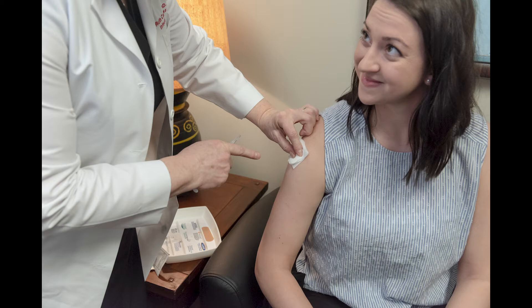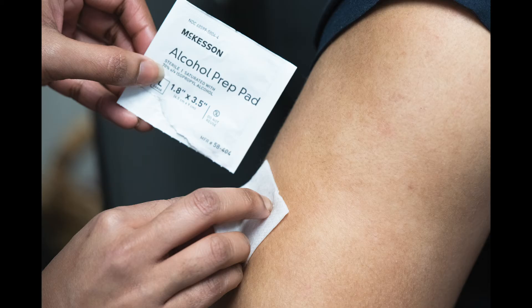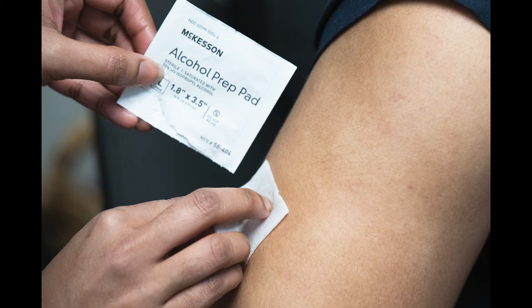Take your time and make the patient comfortable. Talk with them about assessing the site. Use a sterile alcohol swab to disinfect the injection site skin area. Please avoid using alcohol soaked cotton balls or unsterile alcohol swabs.